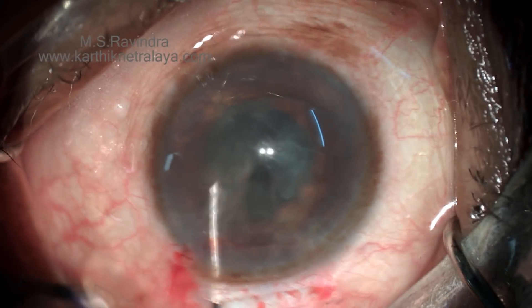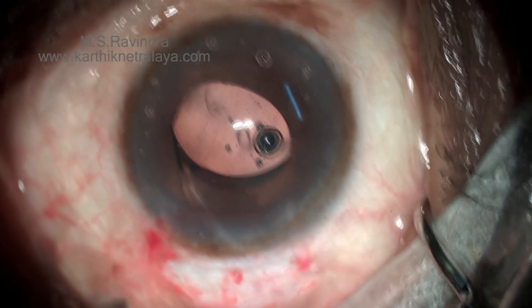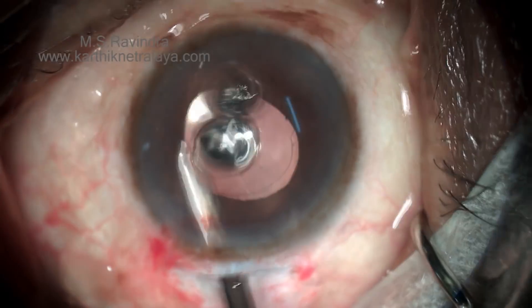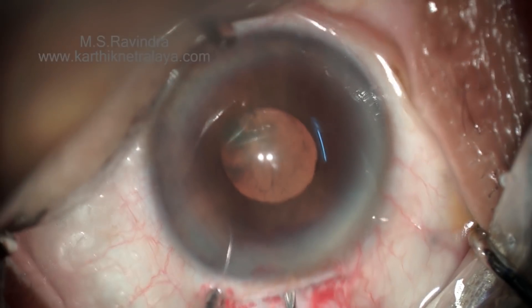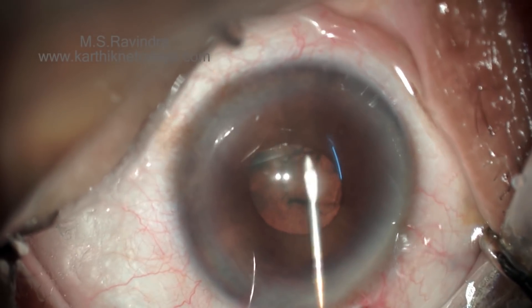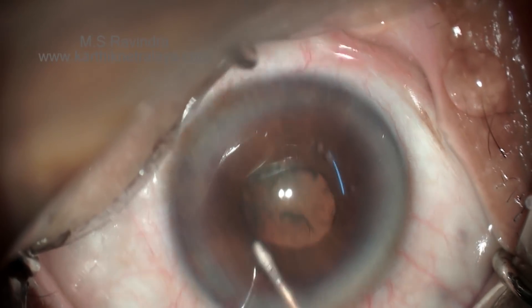The cortex is aspirated carefully and the lens is placed in the capsular bag. As this is a low-pressure technique, I have never had an inadvertent tear in the posterior capsule, which usually occurs because the capsule is weaker — there is a differential pressure on the central capsule as it is the first area to lose mass. This technique totally eliminates posterior pressure in the anterior chamber, giving a very comfortable surgery even for posterior subcapsular cataracts including plaques on the posterior capsule.